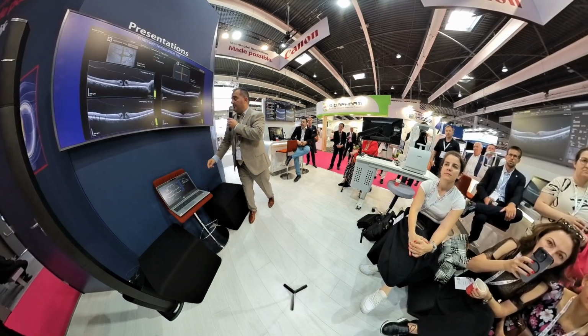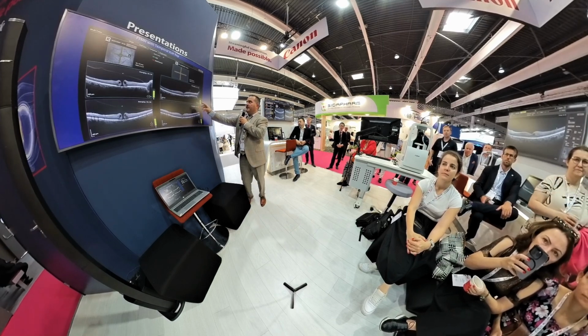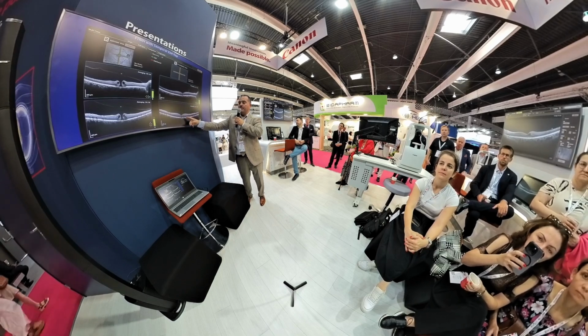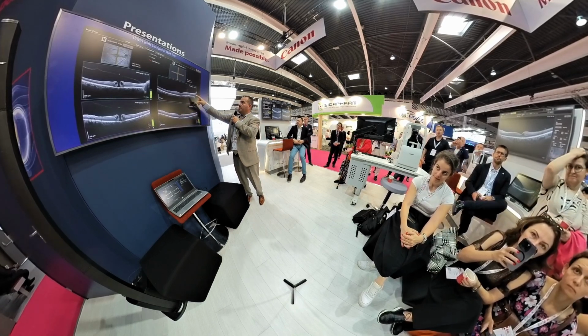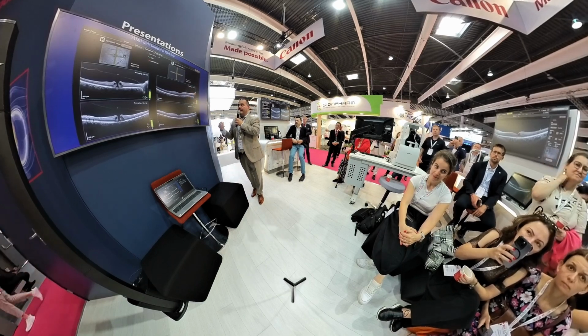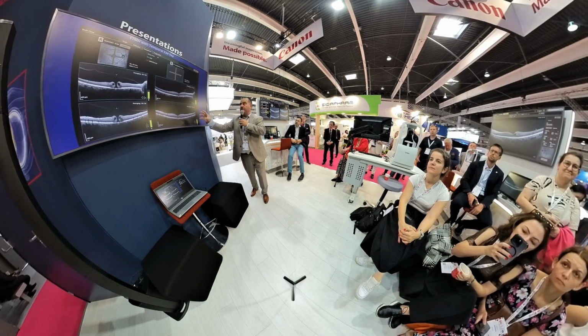So this should be the follow-up image on the same patient, and you can see that a week after the first image, the closure begins to form, and the patient function is already 0.6 here, and you can see some of the flap which is there. So again, CANON means high resolution image.